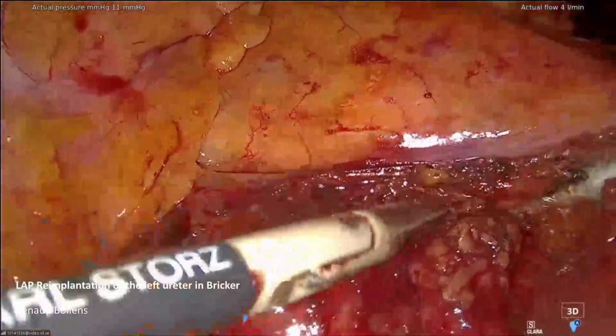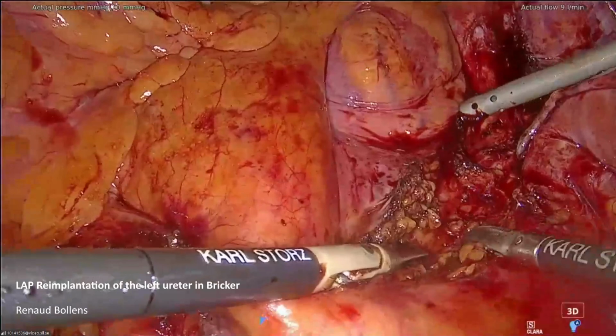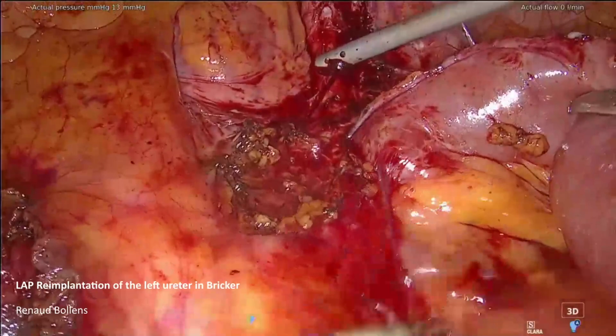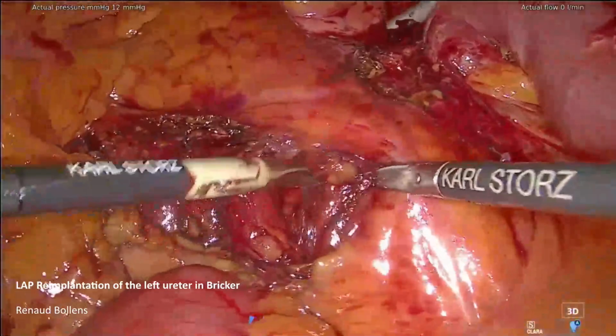Okay, can you release? And you can see that this is one side. And you arrive on the other side, but this part is very bad. It's only fibrosis. It's the reason why I didn't try to search my ureter at this level, because, of course, the closer I am to the bladder, the higher the risk to catch the wrong ureter. It's also very important to remember that you have the right ureter somewhere. When I'm close to the bladder, I can see a tube, believing that it is the good one, and in fact I re-implant the wrong ureter. It's important to be careful.